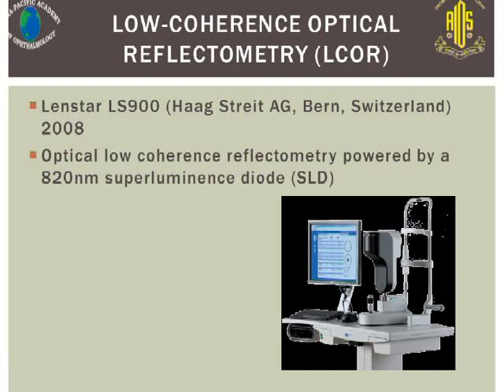So besides the axial length, it can also measure the central corneal thickness, the AC depth, the lens thickness, and the retinal thickness. The AC depth is defined as the measurement from the corneal endothelium to the anterior lens surface, which is called the AD as illustrated, whereas the ACD, like the IOL Master, is from the corneal epithelium to the anterior lens surface.